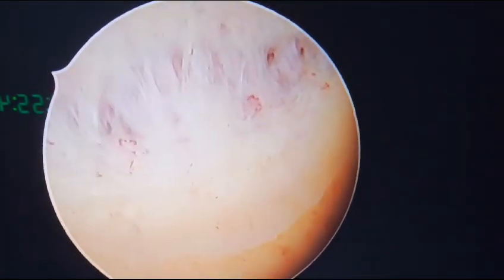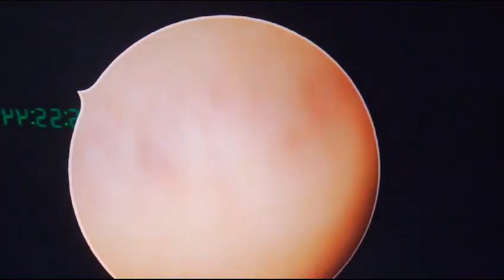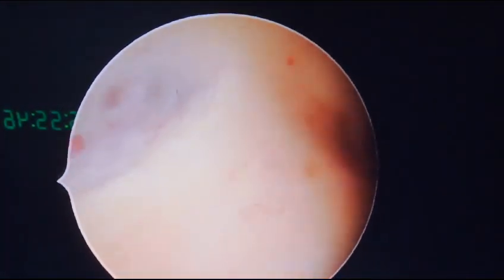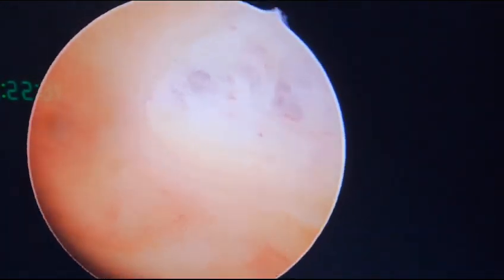Gentle. We'll reduce the intrauterine pressure. Yes, we can see the bleeders from the myometrium. Can you see it? Yes. So these bleeders are not of much worry to us. So we have released the fundal arcuation and we have resected nicely.